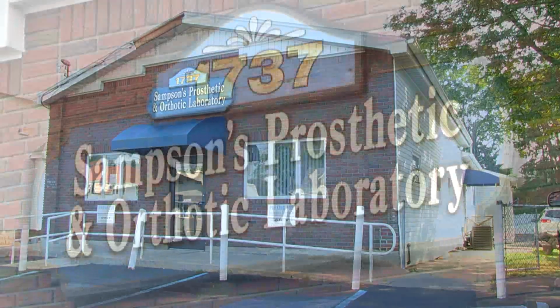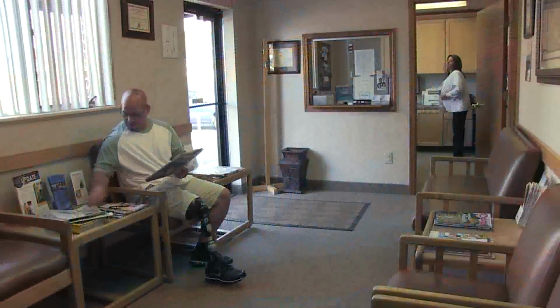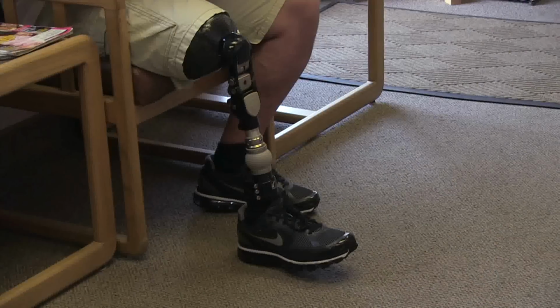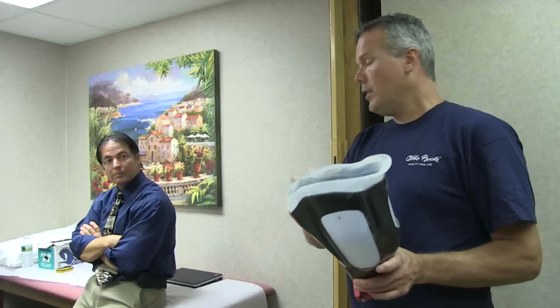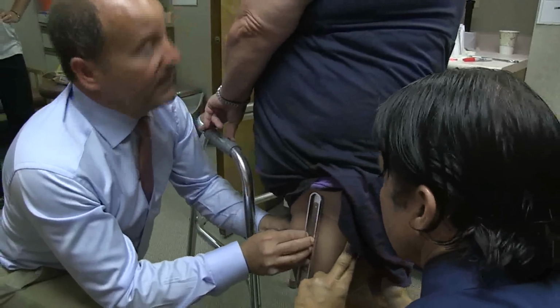We have several patients here today in our office at all levels, upper and lower limb amputees, and we are incorporating the high fidelity socket interface, and we're fitting them with this new technology.